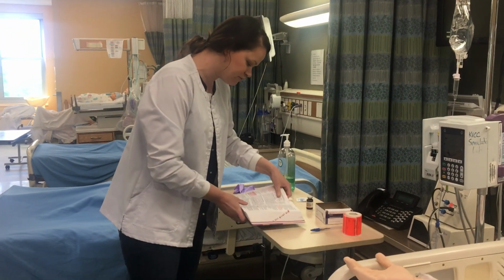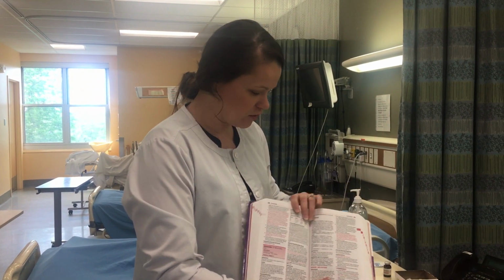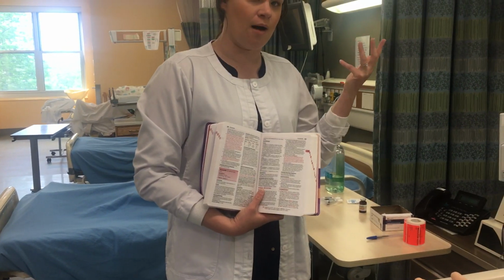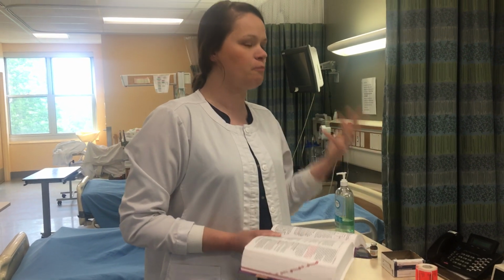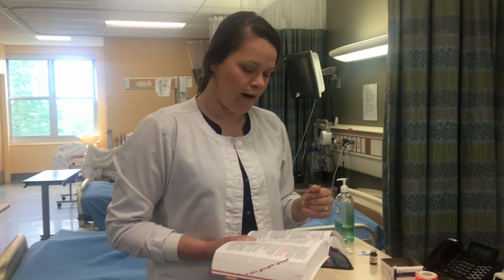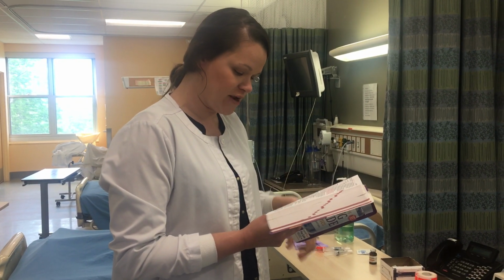So the other thing that I have done is look in my Davis drug guide, and I've gone right to furosemide, and there I can find under the IV administration the IV push guidelines to help us in preparation for this. The big things that are important when we are going to administer a medication via IV push is to understand how fast this medication should be given and if it needs to be diluted. Most medications are no longer diluted, IV furosemide being one of them. And it also says here that our rate of administration will be at a rate of 20 milligrams per minute.